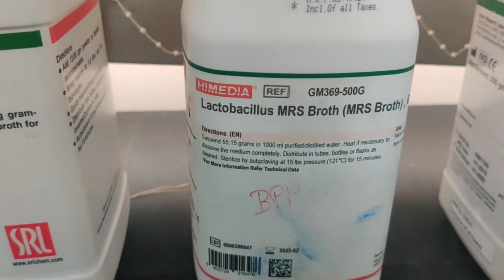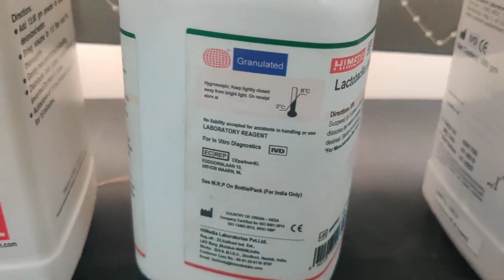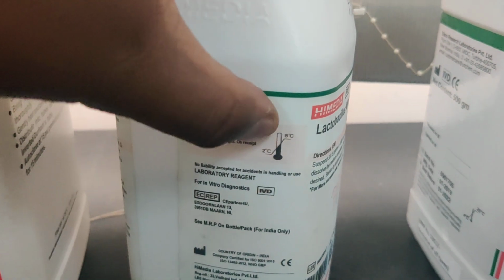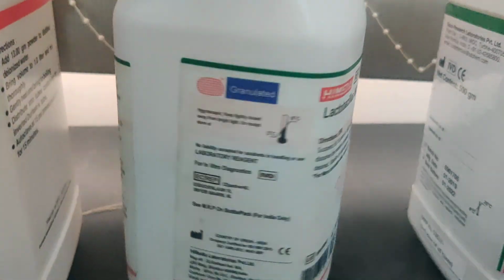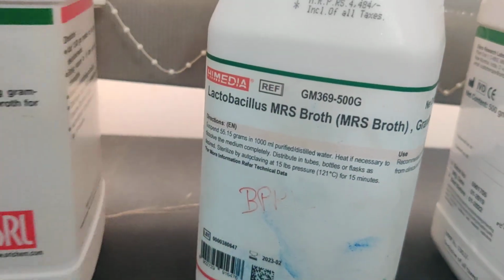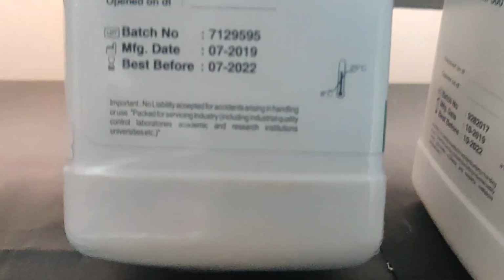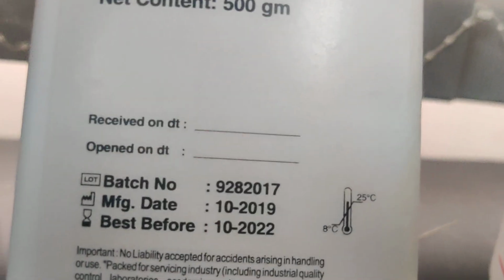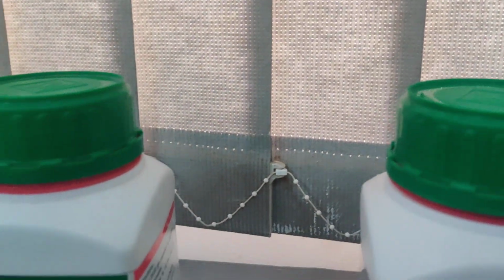If you go for Lactobacillus MRS broth, this has to be stored in a refrigerator. It is in granulated form. You can see the temperature range, so you have to check where to store the medium. If it has to be stored in a refrigerator, then you store it in a refrigerator. But the other mediums need not be refrigerated; it will just show 8 degrees Celsius to 25 degrees Celsius, and for nutrient broth it is 10 degrees Celsius to 30 degrees Celsius. The details are given in such a way.